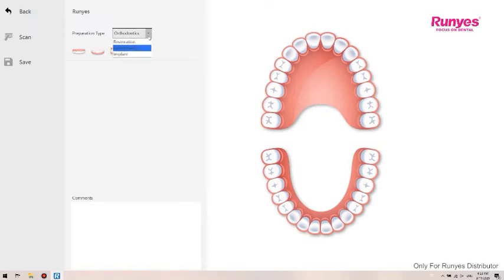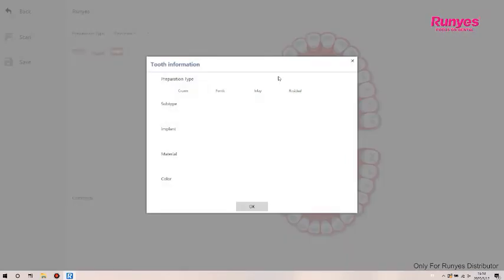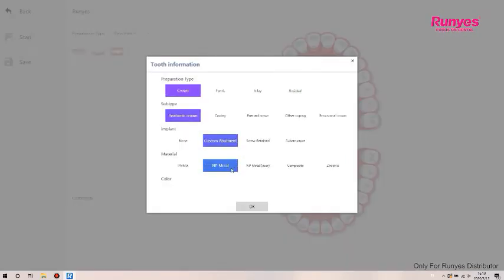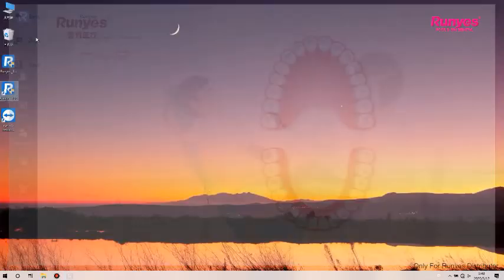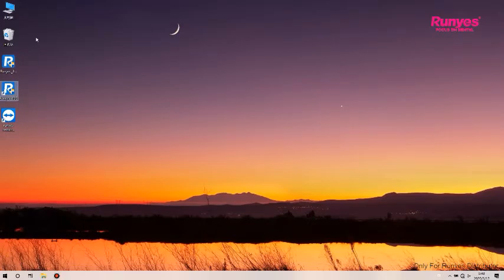The scanning process of implant is upper jaw, lower jaw, occlusion, without scan body, with scan body, and finally select whether to scan the occlusion again according to the situation. It is recommended that the users select the scanning methods according to the actual needs. Users can select tooth positions and fill in all the tooth information according to the patient's situation. Click Scan to enter the scanning interface.